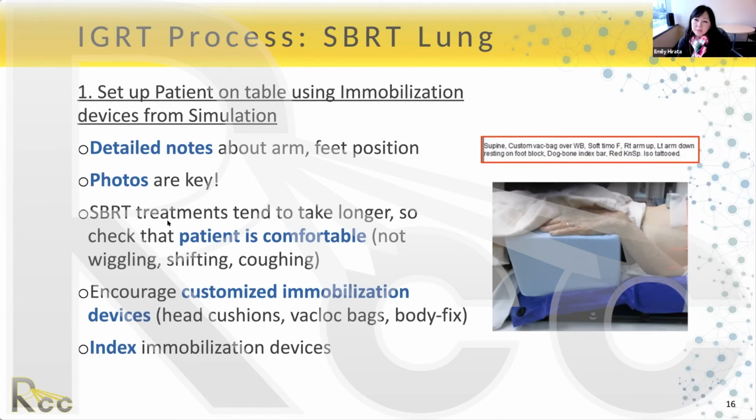Keep in mind that SBRT treatments tend to take a longer time. They're only in for treatment for a few fractions, 5 fractions as opposed to 25 or 30 or more. But those sessions can take a long time depending on the case. So it's really important that the patient is comfortable. They're not wiggling, they're not shifting, they're not coughing. And so details like this can be really helpful.